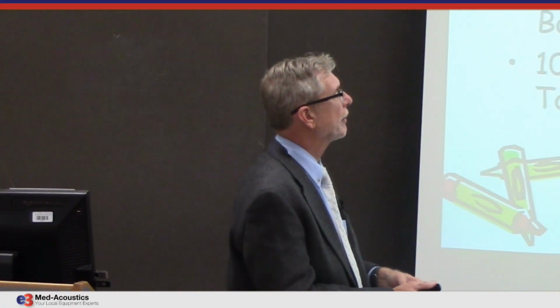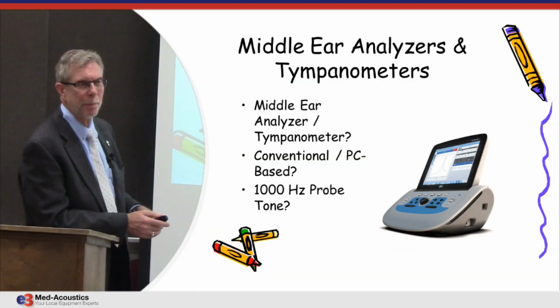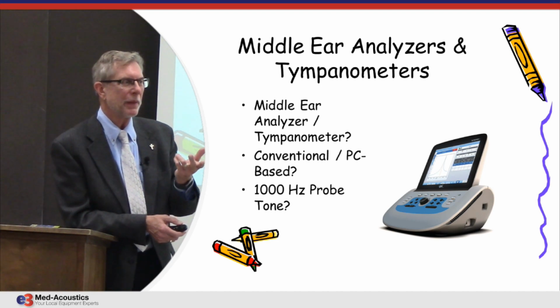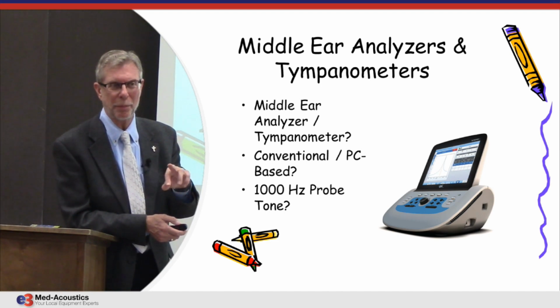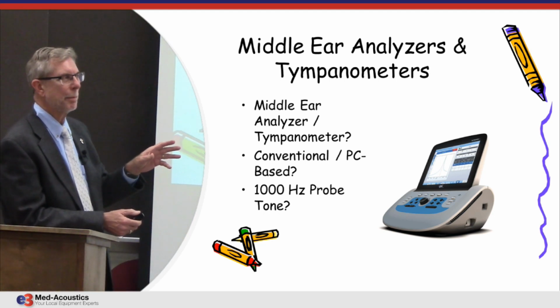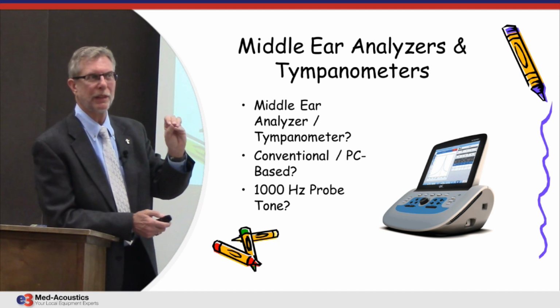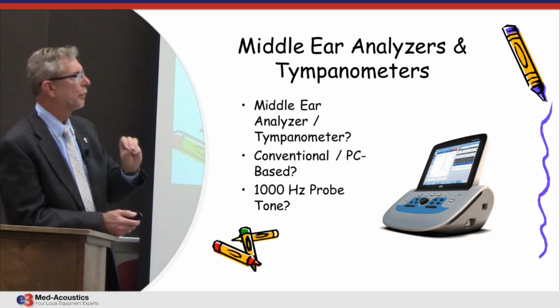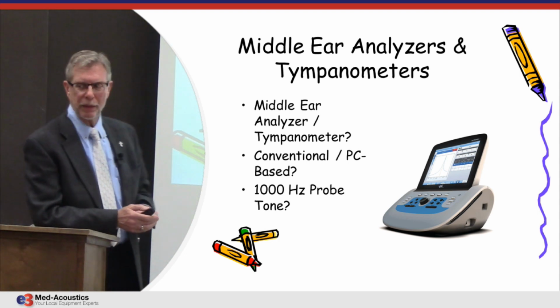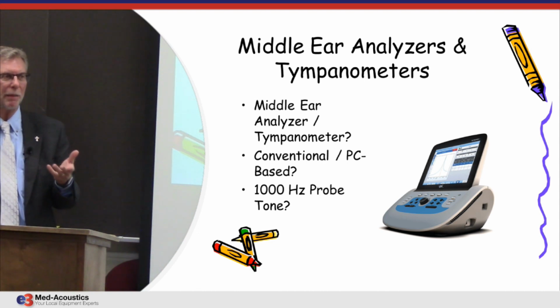Let's talk about middle ear analyzers and tympanometers now. These terms, middle ear analyzer and tympanometer, are interchanged by the manufacturers too. Some of them call everything a tympanometer, and some call their more clinically complete units middle ear analyzers, which is probably the correct way to go. And so the first decision is, well, do you want a middle ear analyzer or a tympanometer?